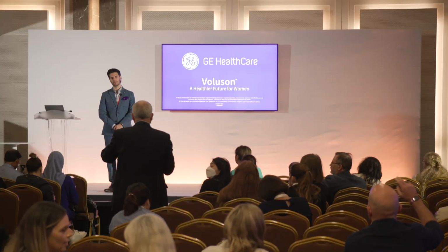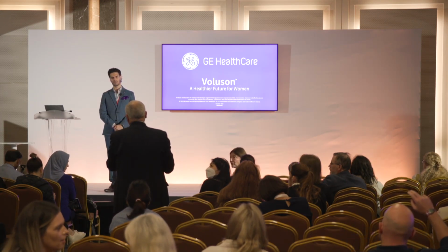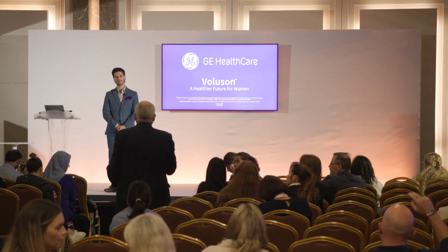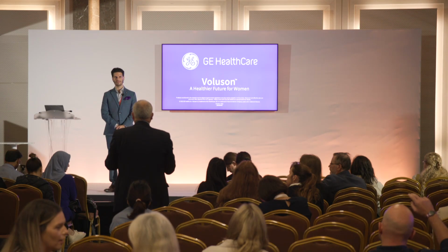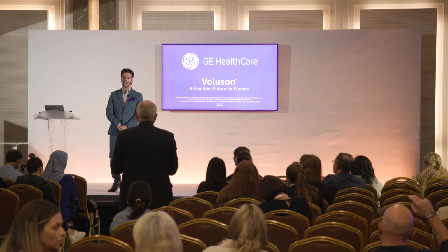And now another question in opposite. If you're already on the ultrasound, find endometrioma, find even deep endometriosis, do you still search for these subtle changes, or do you think, no, I've found enough already, it has to be treated? Yeah, I'm a little bit less crazy when I see the other deep or ovarian endometriosis. I don't go trying to find all the superficial deposits. Sometimes you see them, and they're there, so you capture them, you characterize them.